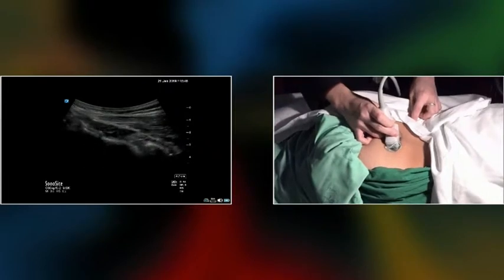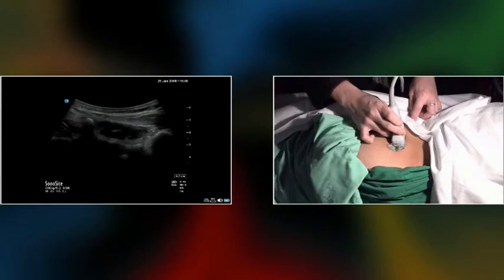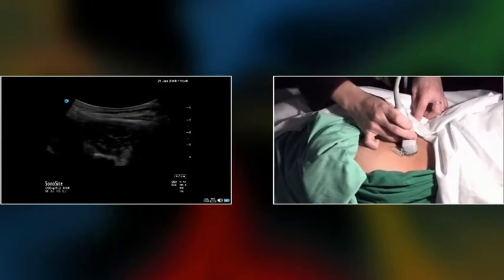And then you can keep scanning up. You can see another hole here, another gap here also. I guess this is probably S1, right? And then you can see on the right side, the ilium bone getting bigger and bigger, and it's gonna turn to be the PSIS soon.